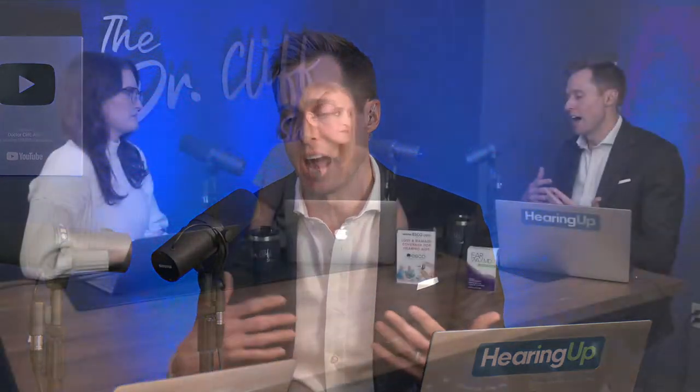I'm not exactly sure. Yeah, absolutely. You can probably blame FedEx and UPS a lot for the issues that you see with these test box measures. But it just makes it all the more reason that you have to test it, because you just can't trust what has happened from the time it left the manufacturer to the time it got to us. I think that possibly during COVID, maybe they got a little lackadaisical at the manufacturers. I don't know, but if you ask other providers, I think we all feel the same way, that the rate of devices not meeting specifications increased substantially during and following COVID. And I have to think that the only other variable that has potentially changed is on the manufacturer side, maybe things are slipping through the cracks a little bit.